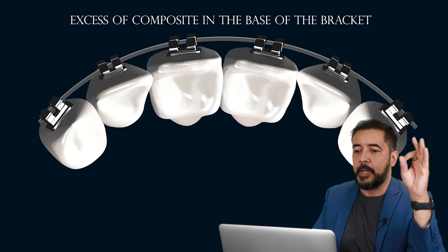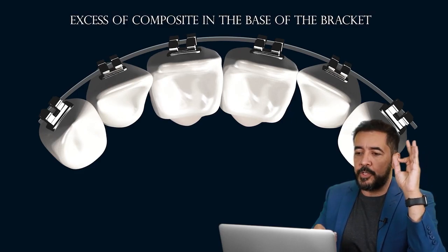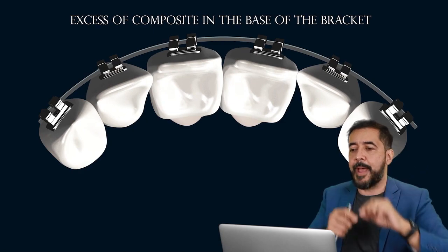So this is important. Another thing that is important is to avoid the excess of composite in the base of the bracket.